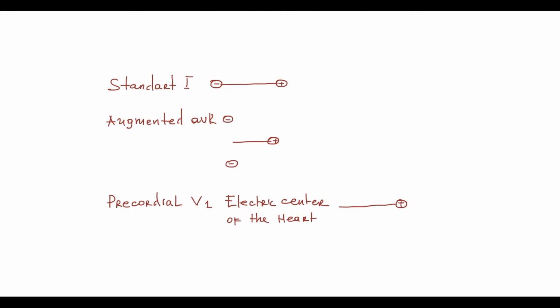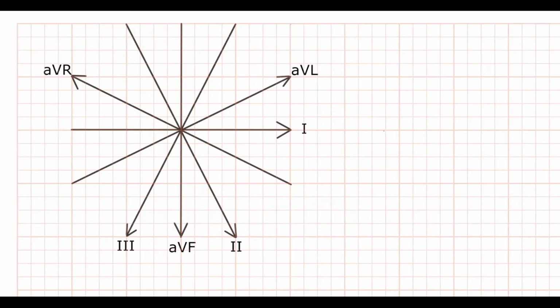We will discuss in detail every type of lead, but even now it's obvious that positive electrode is present in every type of lead. It's because heart electric activity on ECG is depicted only by a positive electrode. That's why positive electrode is also called active electrode, and to distinguish it, active electrode is marked by an arrow. For example, in hexaxial system it's first lead.